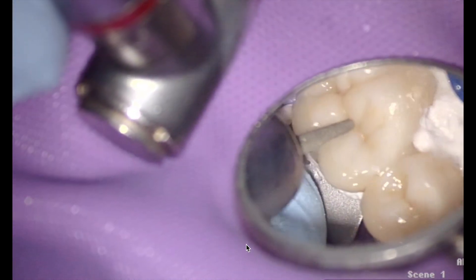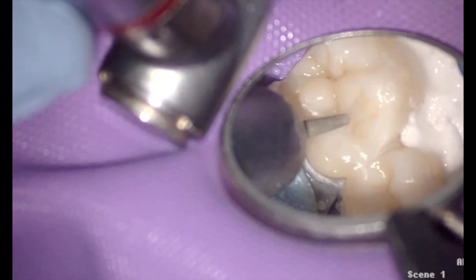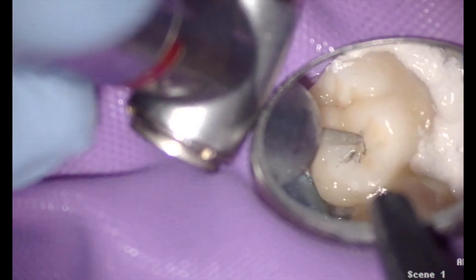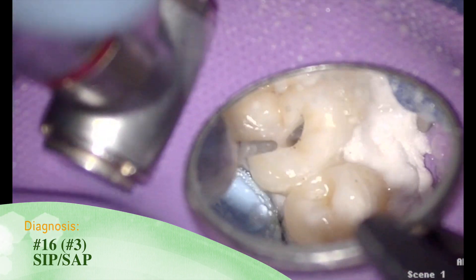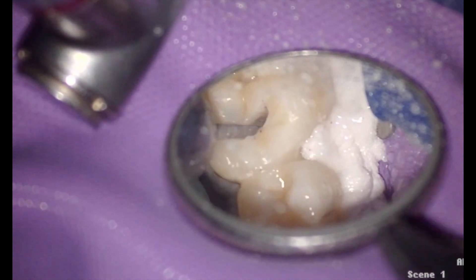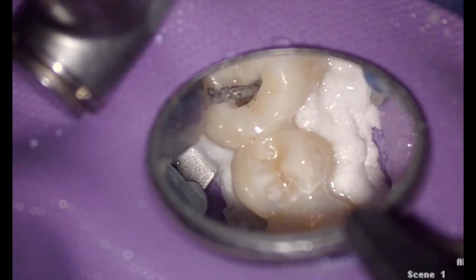Let's go to the video. This is my buddy Magid's practice — he's a prosthodontist, so I do his root canals. He has zirconia burrs. This one flamed out real quick — it said zirconia on it but it didn't really work, so I grabbed another one. We got through the zirconia, but then this one flamed out again. Watch the cutting pattern — I burned out the tip but maybe I can keep going.